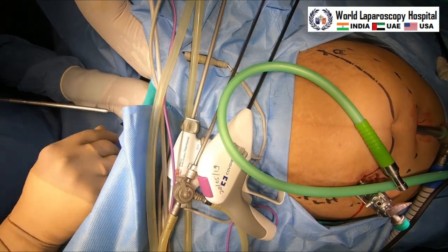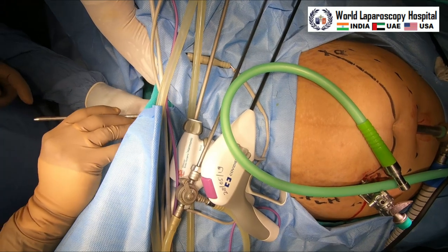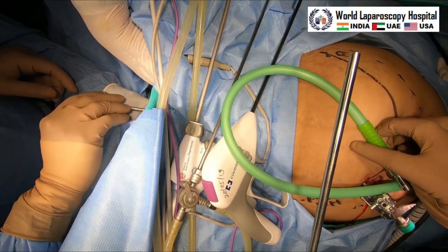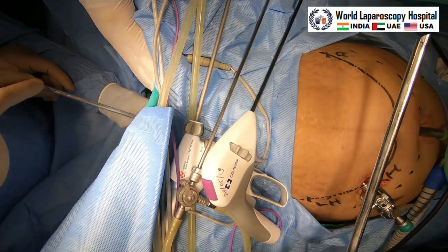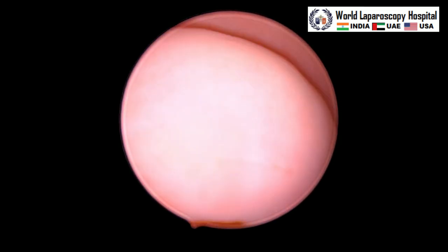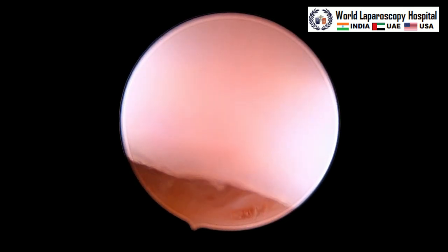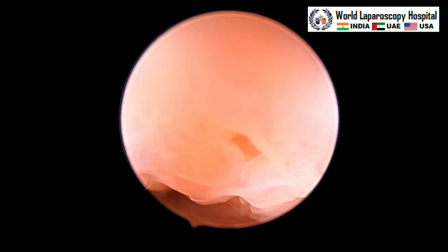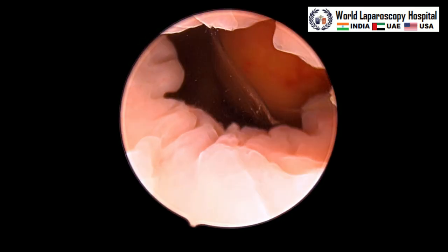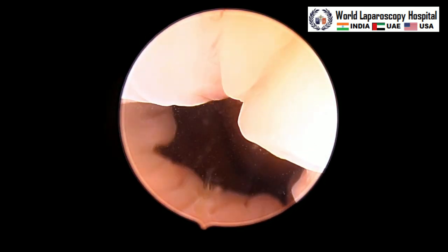Then we do diagnostic laparoscopy. After that, we will do hysteroscopy. Also in this case, just to confirm at which wall of the uterus there is attachment of the myoma. MRI of this patient has shown a 6 cm myoma which has indentation of approximately 4 cm in the cavity. So this is a grade 1 submucous myoma in which the maximum is in the cavity and one third is approximately in the muscle. Any myoma which is more than 4 cm in size, you can do hysteroscopy, but it doesn't have a good outcome, and you have to do it in multiple stages.